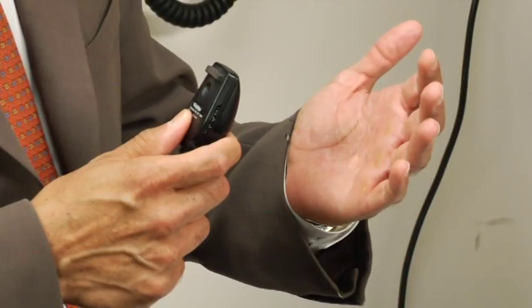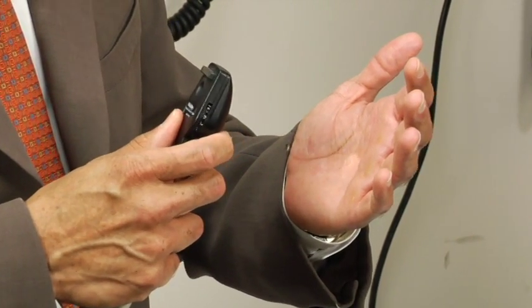So it's very important to try to position the patient as best you can, typically in a sitting up position, and also try to be at the same level as the patient to optimize your visualization of the posterior segment. Also, it's very important to realize that when you're going to be looking at the back of the eye, you'll be using a direct ophthalmoscope. And because the patient will not be pharmacologically dilated, you want to use the smallest light diameter as possible. Any light diameter that is very large can cause light reflexes that come off of the edge of the pupil that can again make visualization of the posterior segment very difficult.